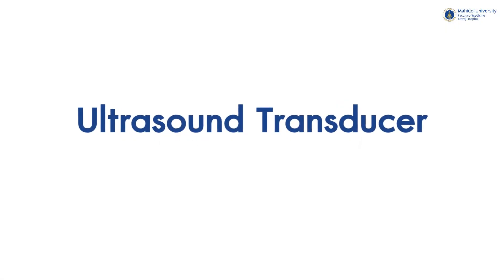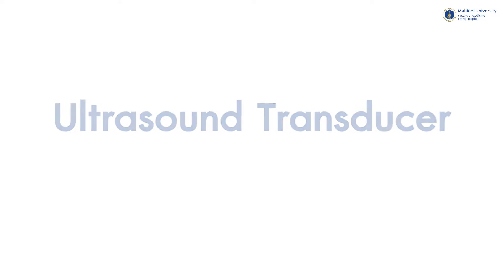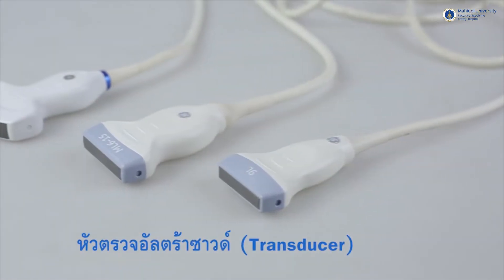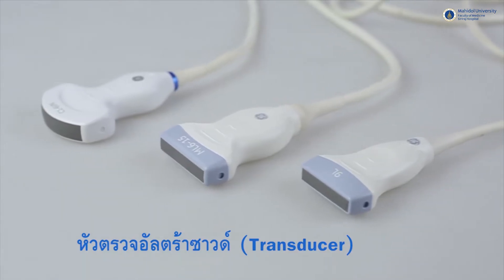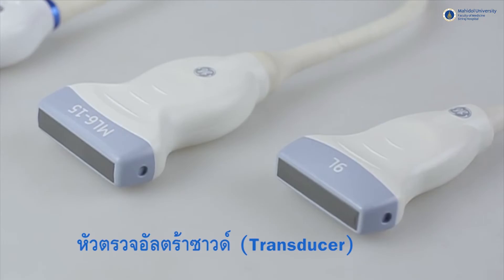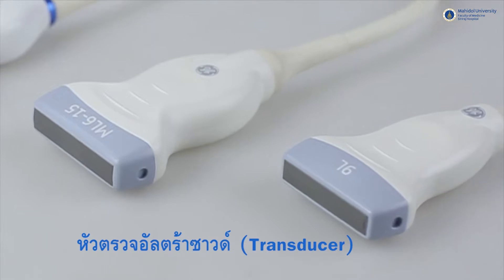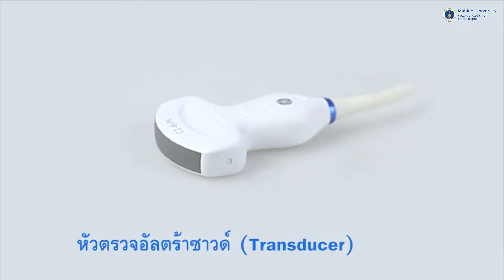One of the most important equipment for ultrasound examination is the transducer, or what we simply call the probe. They tend to vary in sizes and shapes, and serve different purposes. Higher frequency transducers are usually used for superficial organ examination, while lower frequency transducers are used for deeper structure examination.